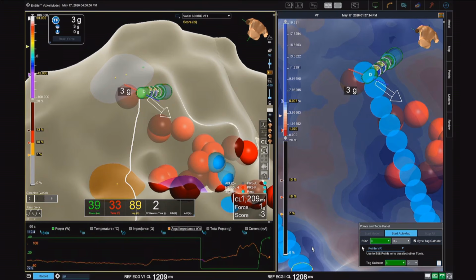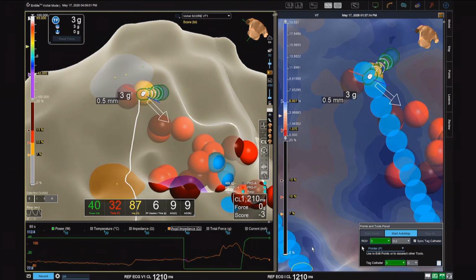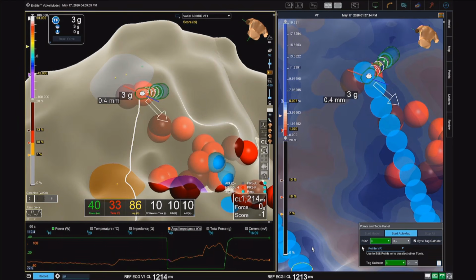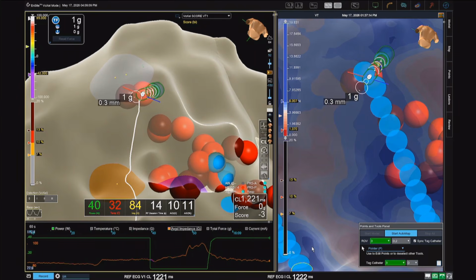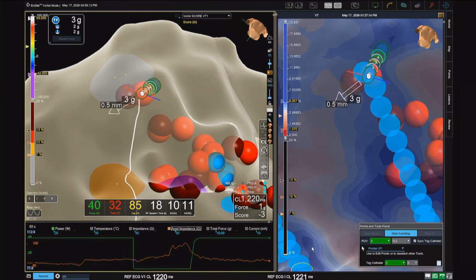The ECGI software shows us one region where you can have an isthmus, a region of slow conduction. What I have to be honest about is that the region where you ablated first was not recognized on that, because you were doing perimitral. I've seen nice conduction to that region.